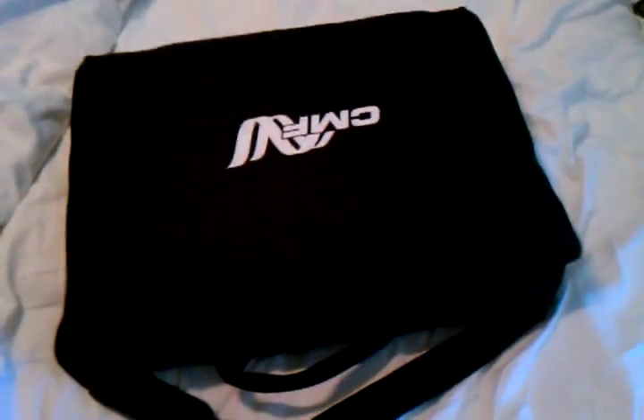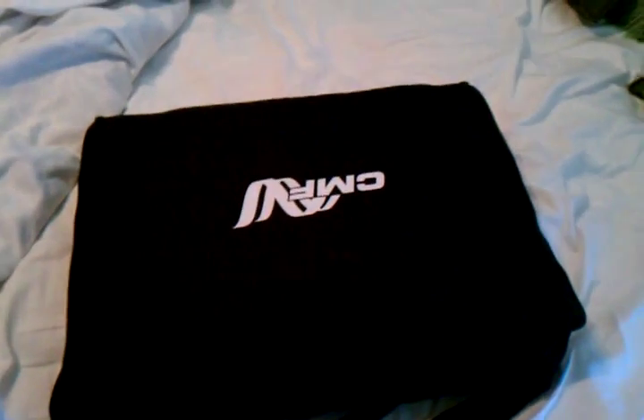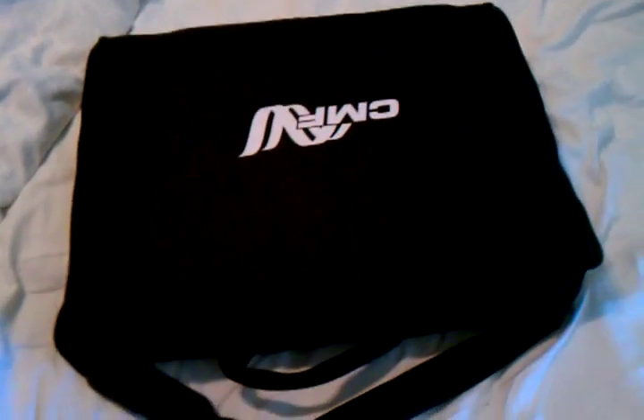Hey, it's Brad again. I got my bone stimulator today — it's been more than a week since I had my surgery and the thing finally came in. I thought I'd show you guys this.